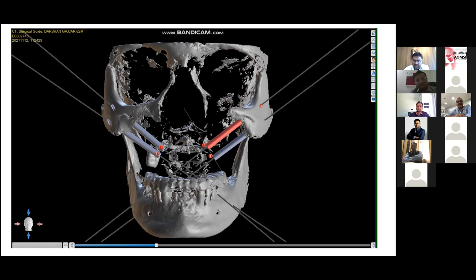My next question to Dr. Haran, sir. Here in this case, we use the conventional zygoma, which has the rough surface third part, which will osteointegrate in the body of the zygoma. Now, compared to that, when we are using the PSI, which is a subperiosteal implant and a screw, I don't think that part is going to osteointegrate with the body of zygoma, if I'm not wrong.